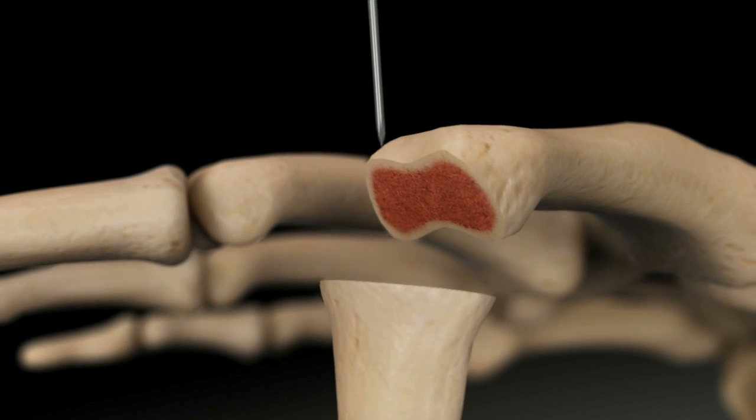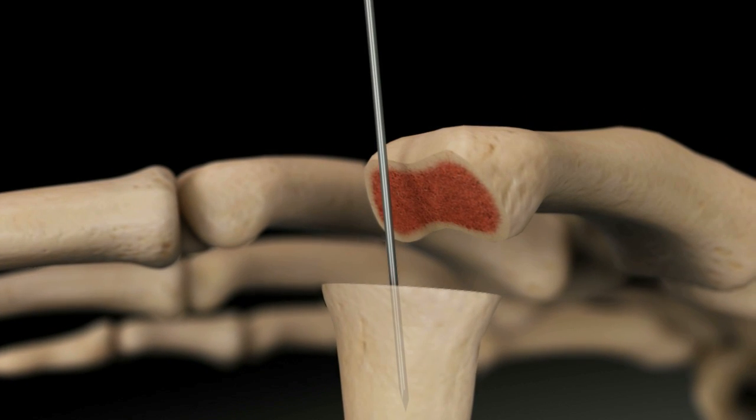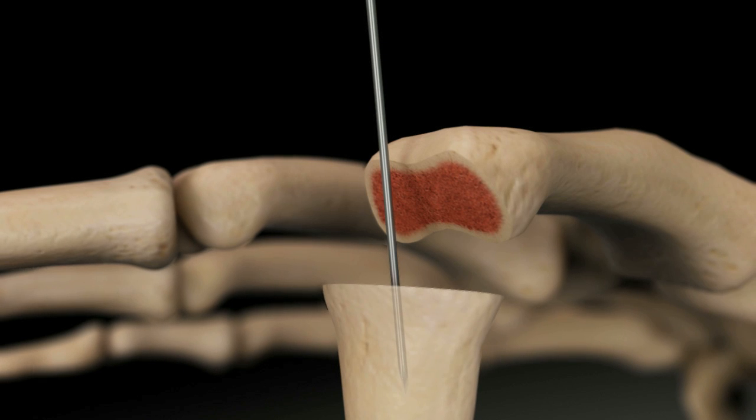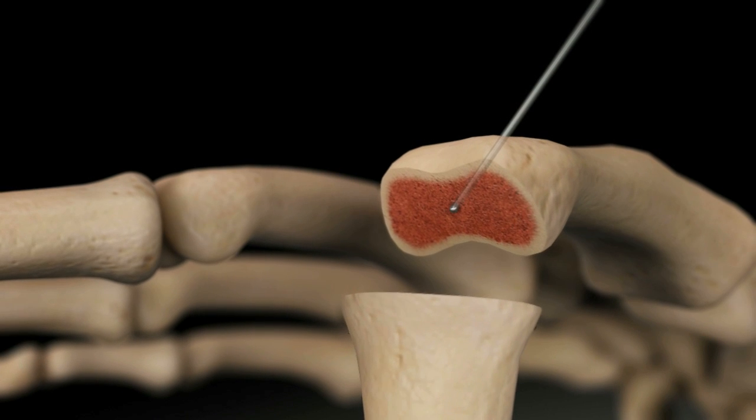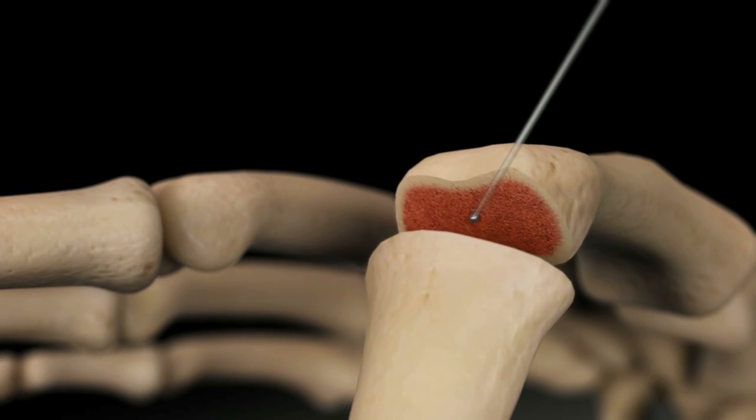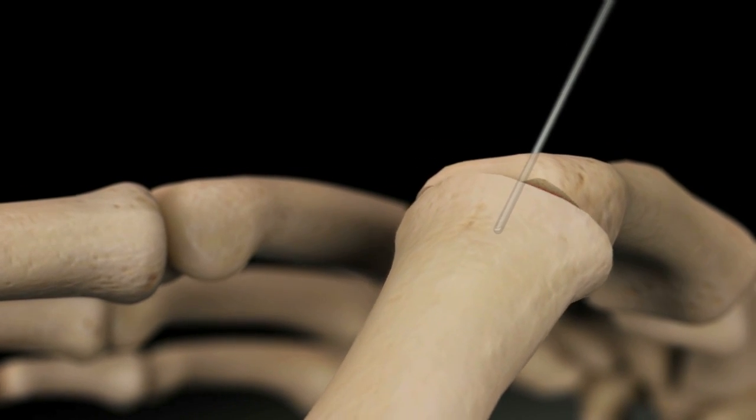Drive a 0.045 K-wire into the distal bone axially to create a guide channel. Remove the K-wire from the distal bone. From the center of the joint, drive the 0.045 K-wire into the proximal bone perpendicular to the joint surface.